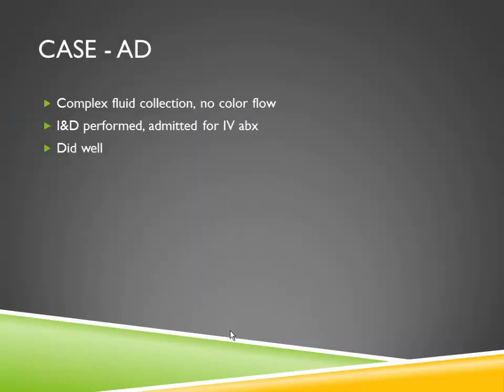And we didn't mention it, we didn't really show it, but we also checked to make sure there was no color, no big vessels right in the path of our knife, and that's an important point. Anytime you're about to stick a knife somewhere, put color on it and make sure there's not a big blood vessel right in your path. And again, this patient did well.